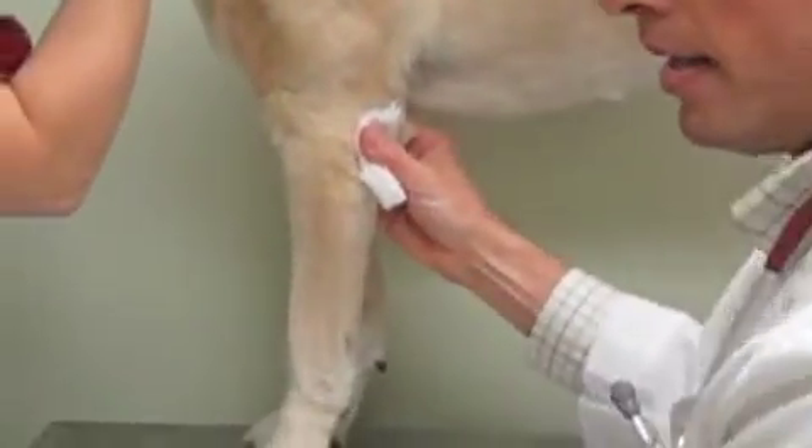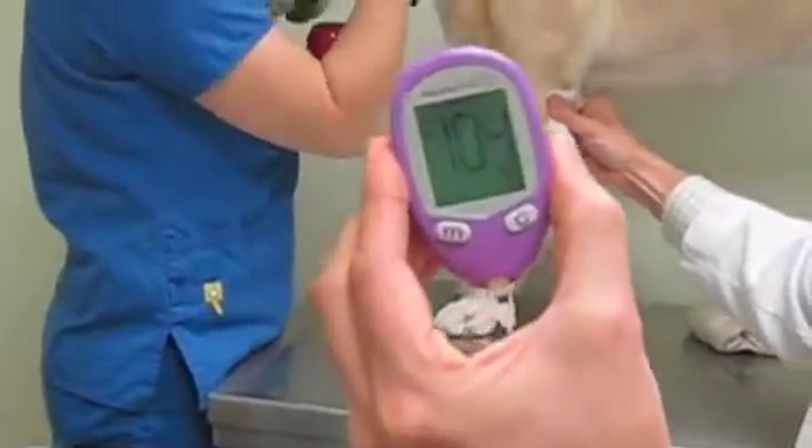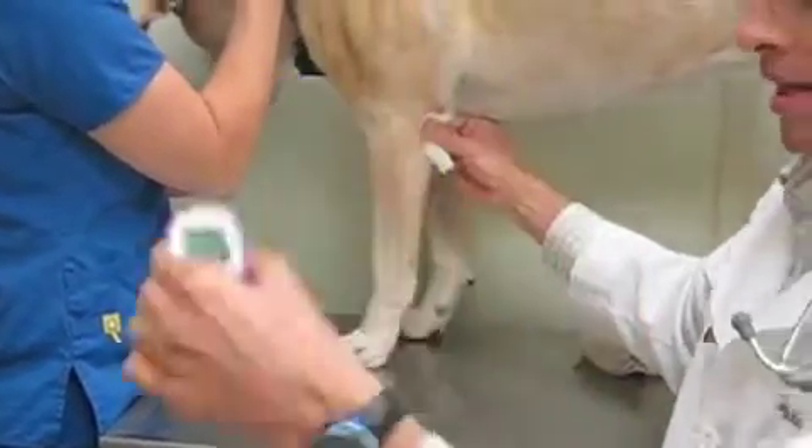A little gauze to hold on, and you'll see it's reading. And it gave us a 104 — a perfect blood sample.